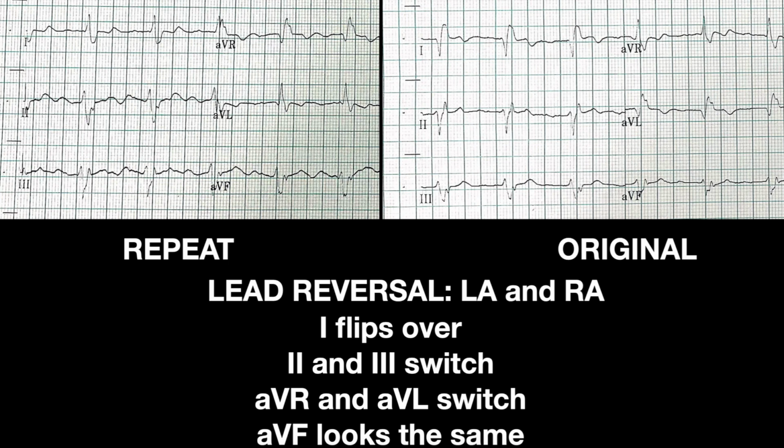But recognize that if something looks funky on this EKG, if you get a wildly weird reading, the thing you should do is take the leads off, stick them back on, and make sure that the first reading wasn't us messing it up. And sometimes you find out that it is, and it's nobody's fault. We all make mistakes, but it can have major implications depending on what you see on that EKG and what you tell somebody about it.